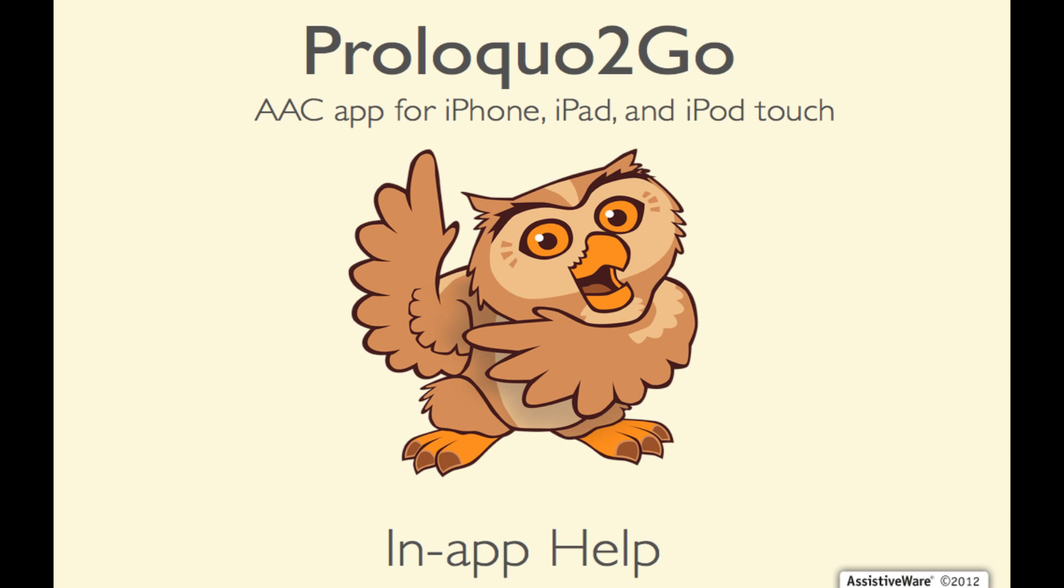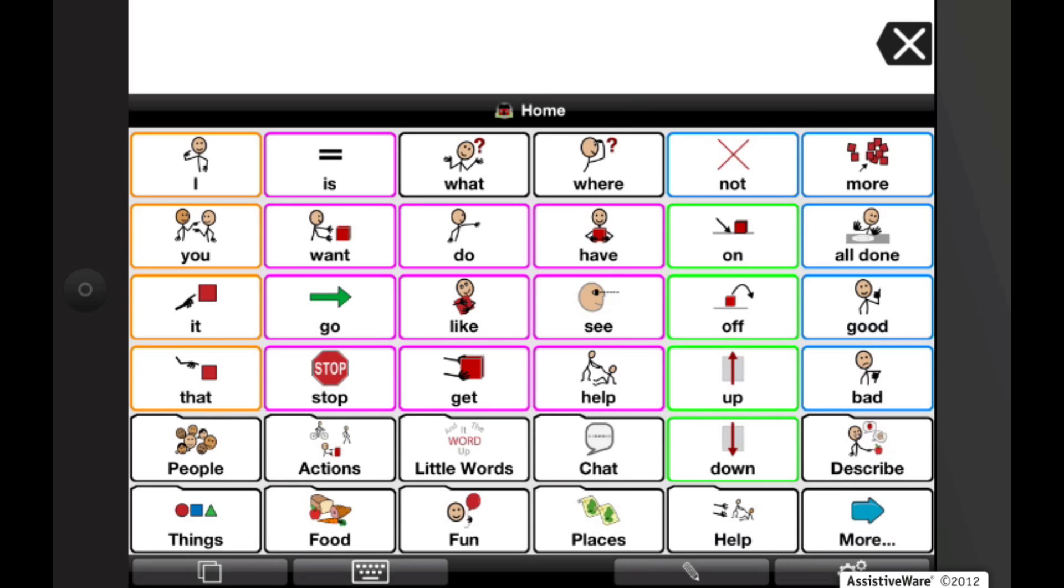Proloquo2Go includes a contextual, annotated in-app guide that provides relevant information on its options and features. In addition, the full Proloquo2Go manual and quick start guide can be viewed on the device and printed to an AirPrint-compatible printer.